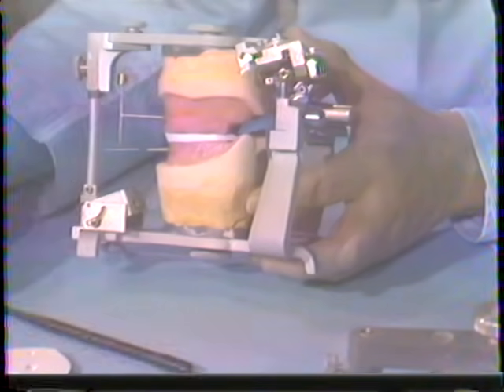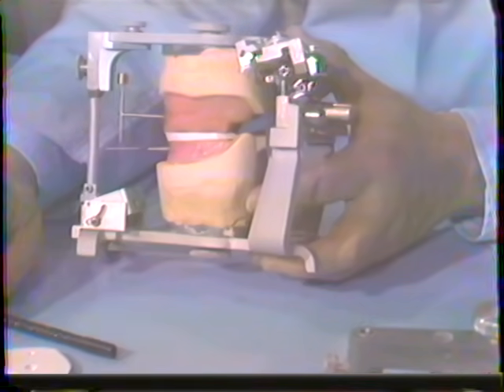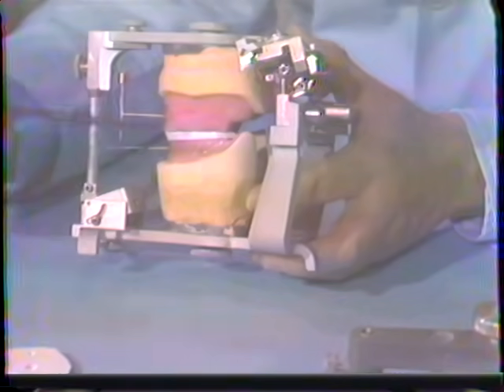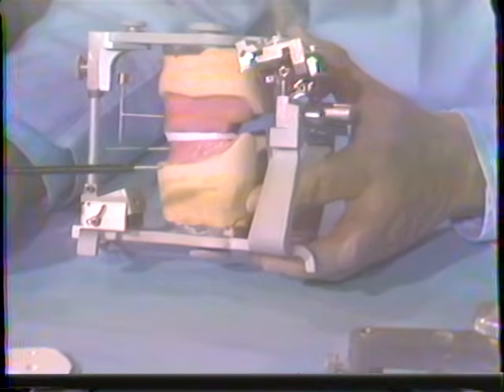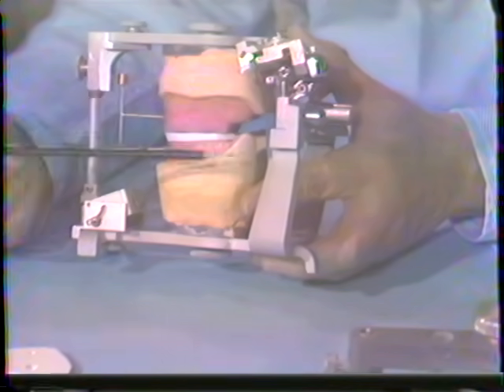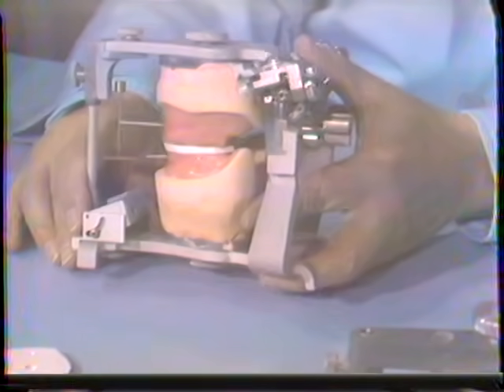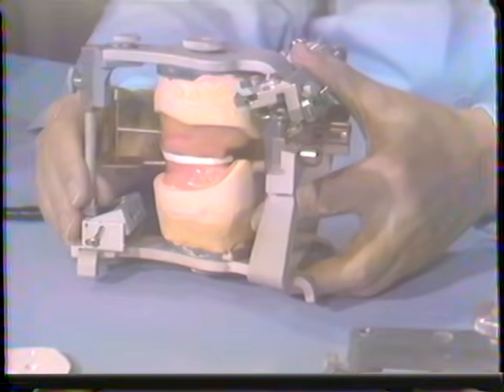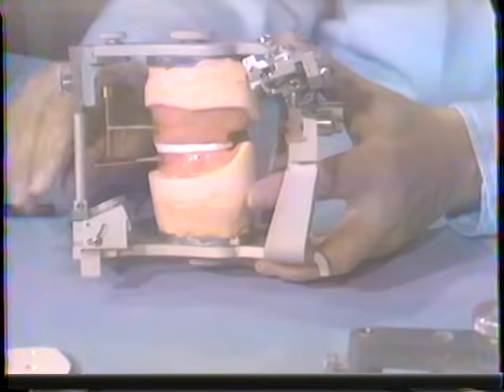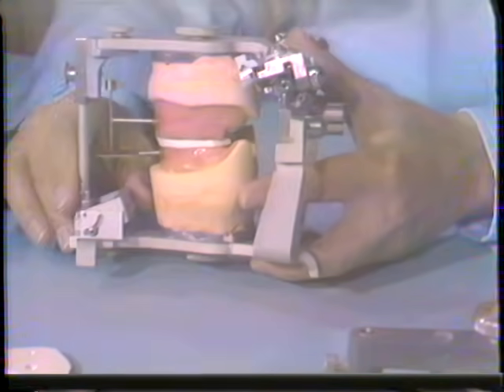But by and large, in general use, and particularly for complete dentures, an effort was made to simplify the instruments, and non-arcon instruments were designed. But lately, this arcon principle has been incorporated again more universally in the later instruments, since about 1960. We now have a number of instruments of similar design of the arcon principle.